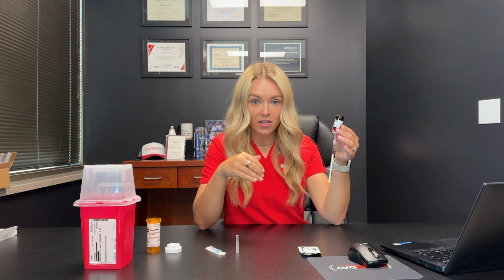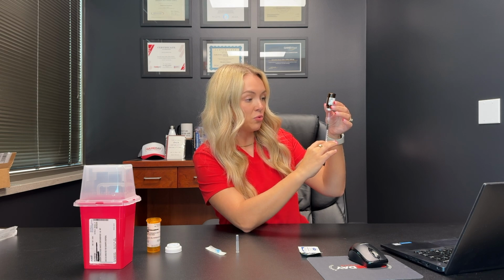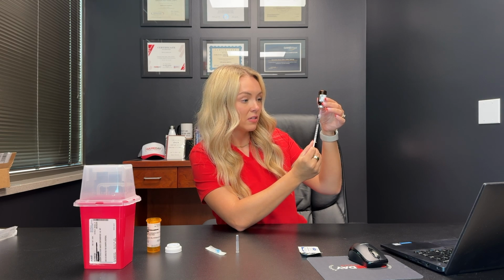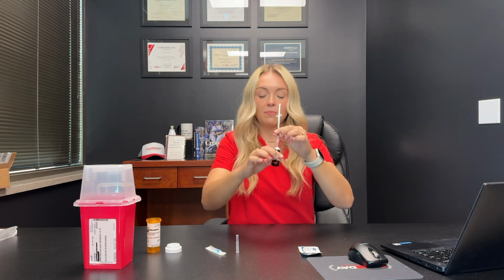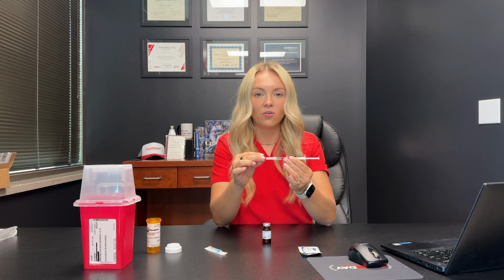If you notice any air bubbles in your medication or in the syringe, you're going to need to get those out. To do that, I'm going to push the medication back into the vial. Once that air bubble has fully returned to the vial, I'm going to pull this back down to my prescribed dose of 0.4 mLs. And then I can flip this back over, take the syringe out, and very carefully recap my needle.